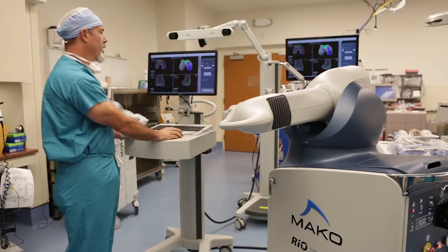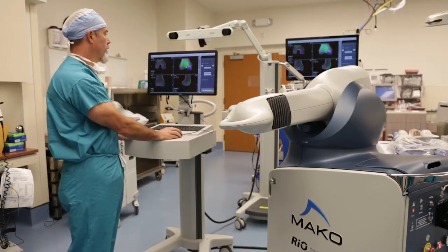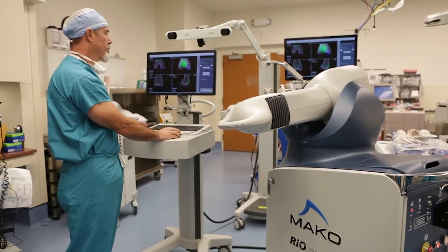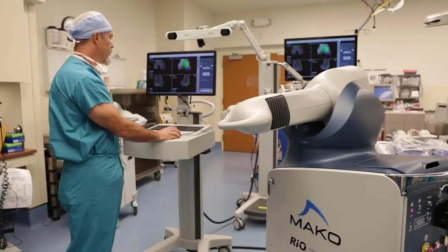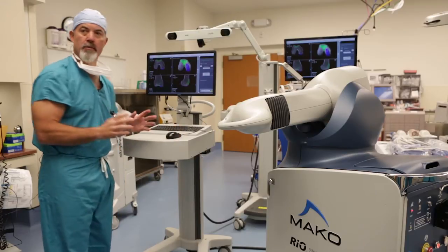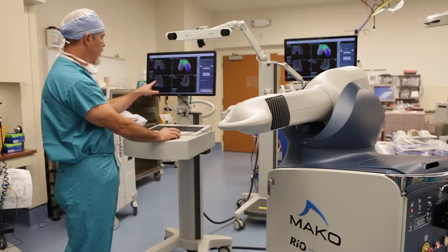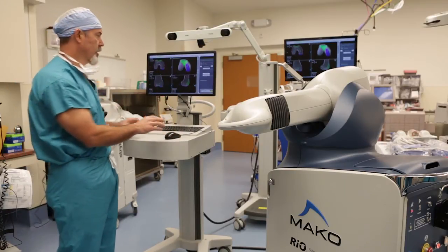For the patellofemoral component, I often go straight to the three-dimensional bone model first rather than starting in the lower right panel, because it gives a lot of information about how the patellofemoral joint is sitting on the bone. I can see the Makoplasty rep has done a great job orienting this on the anterior aspect of the femur. I then go back through the side cut, frontal cut, and axial cut to confirm my three-dimensional assessment is good.